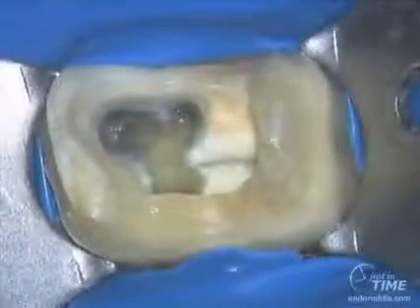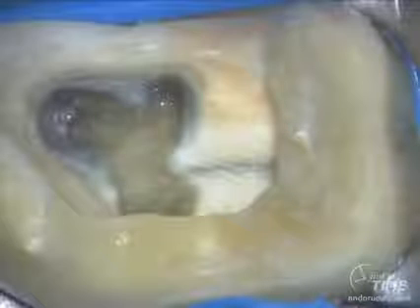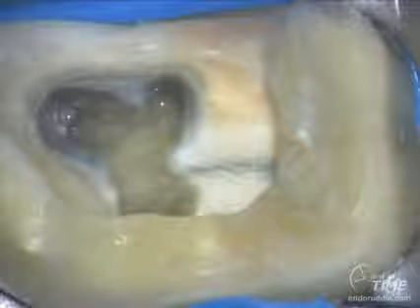And as we now begin to look down into this access cavity, I think any dentist listening to this discussion would say, I could do that. And the idea is, if you just think about your access cavities as a step that needs to be expanded a little bit, maybe beyond what you previously did, and then if you have these ideas on how to finish the access, you're going to do better endodontics.